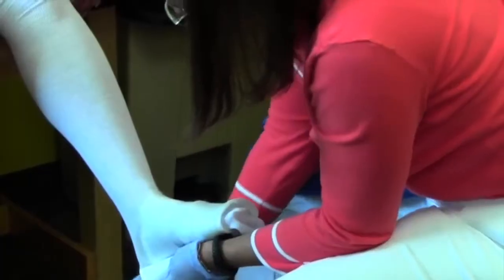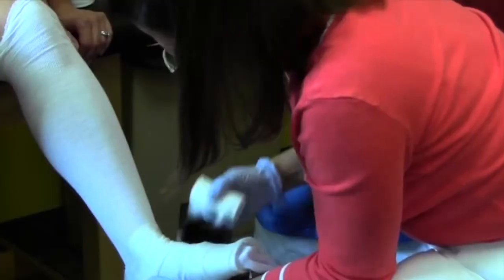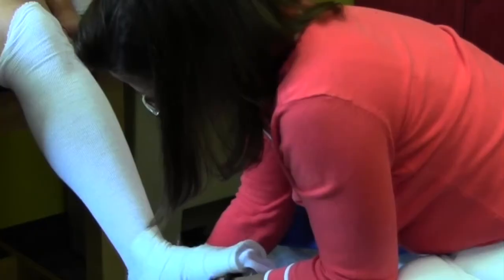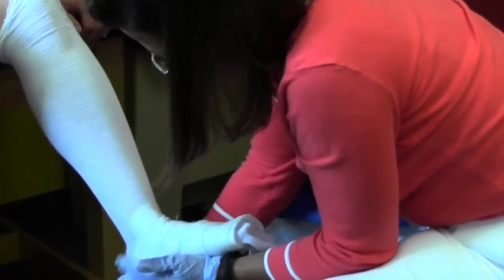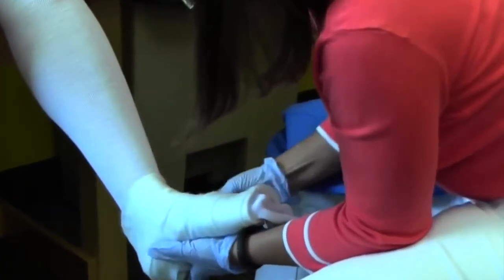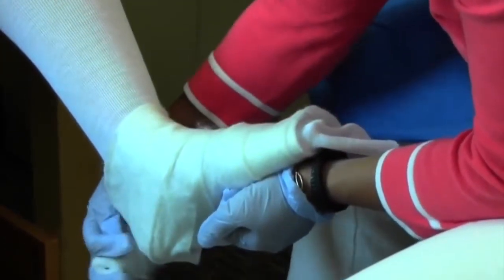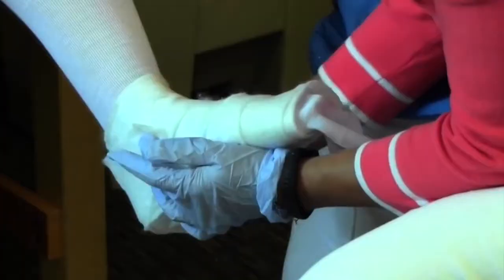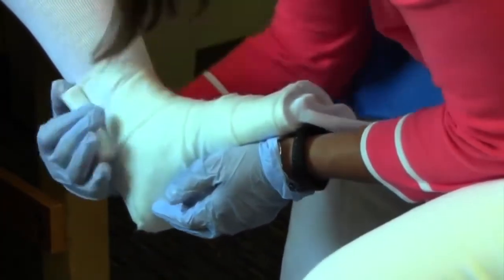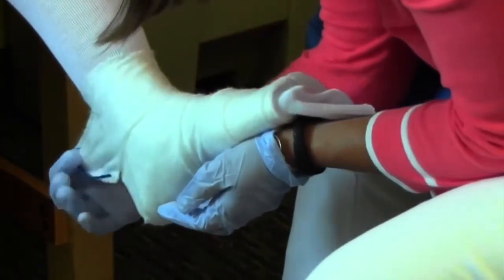The three areas that are most important to cover with adequate but not excessive amounts of padding are the ends of the cast, where there's going to be pressure when they walk, and the heel. To cover the heel, I like to start at the malleolus, come around the heel, cover it again, and come back. It's not the bottom of the heel that needs to be covered, it's the back of the heel, the spot where you get a blister when you wear a new pair of shoes. Most people have never had a blister on the very bottom of their heel. Unless you walked on a deck when it was too hot.